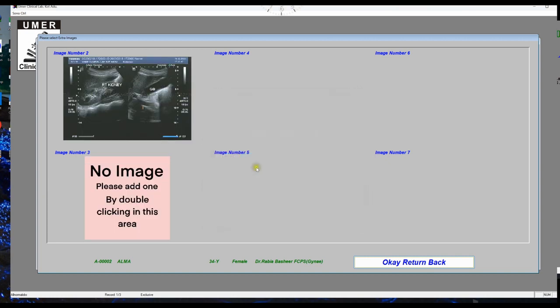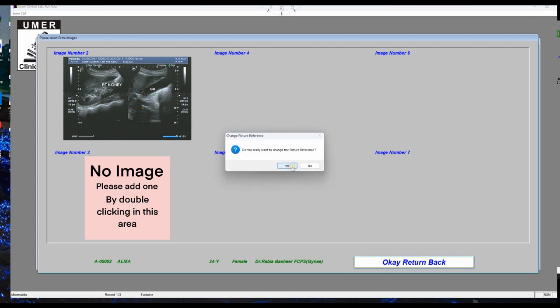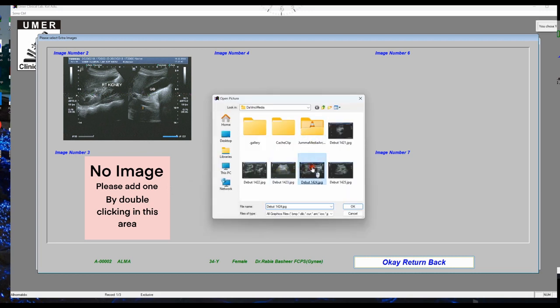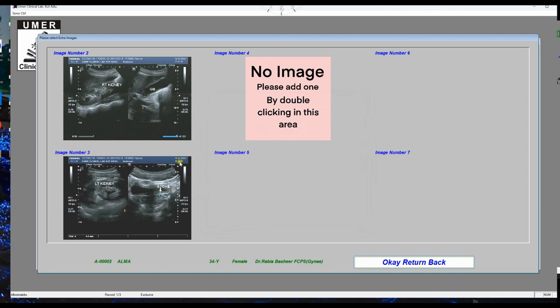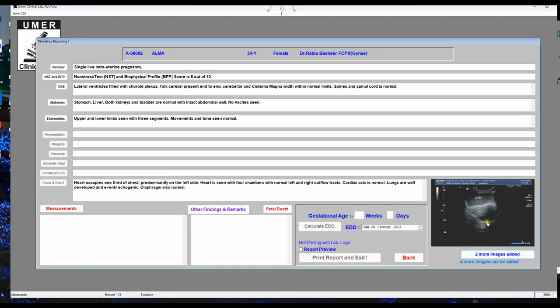Double-click on this button and it will ask you to add more images — click yes. You can also double-click on an existing image area and it will ask 'Do you really want to change the picture?' — say yes, then select another image. Up to seven images can be added. Here you can see that two additional images have been added.